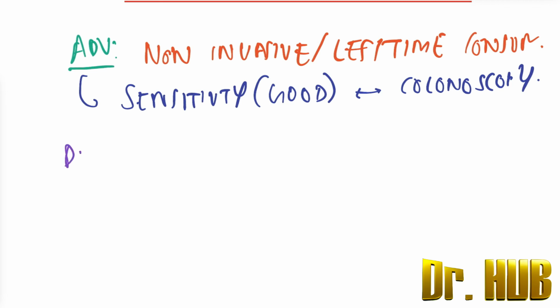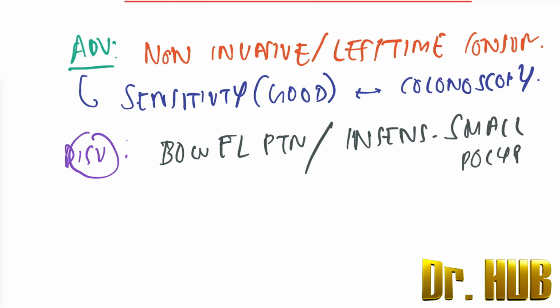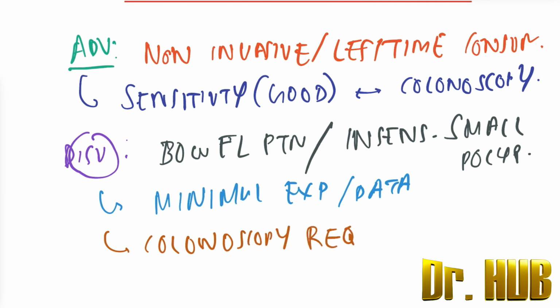So what is the disadvantage of this? The disadvantage is that it requires bowel preparation. Next, it is insensitive to small polyps. And there is minimal experience as well as data. And colonoscopy is required for a positive result.